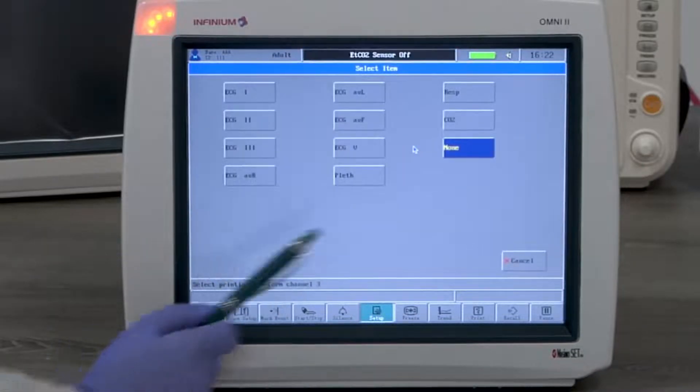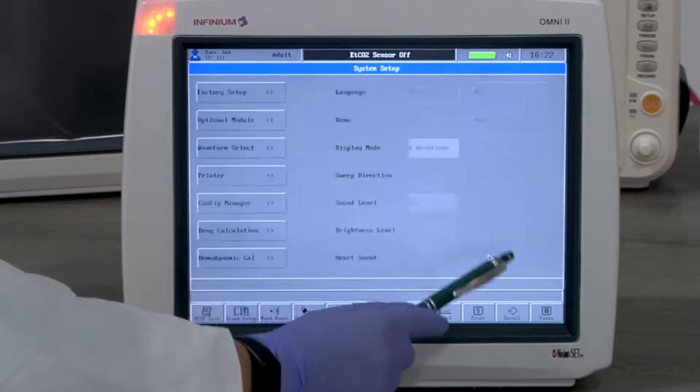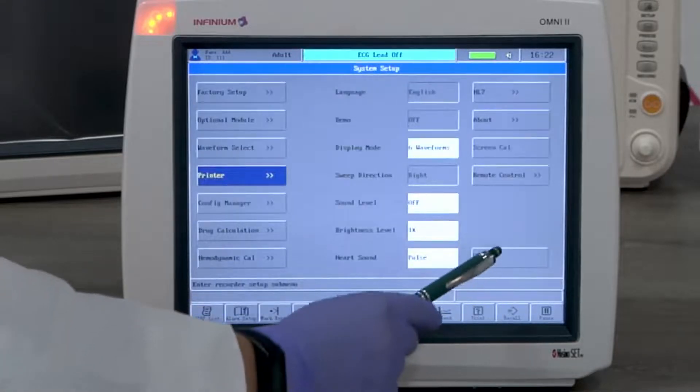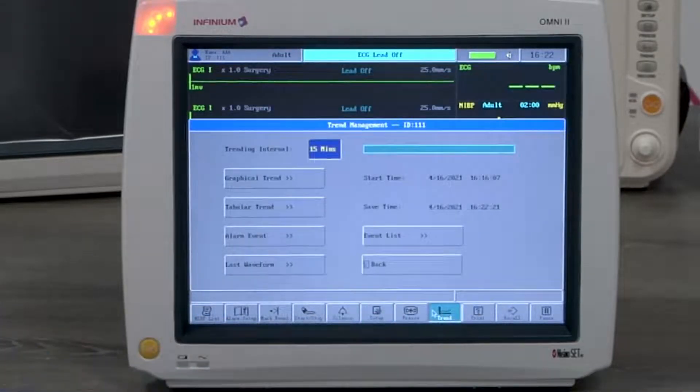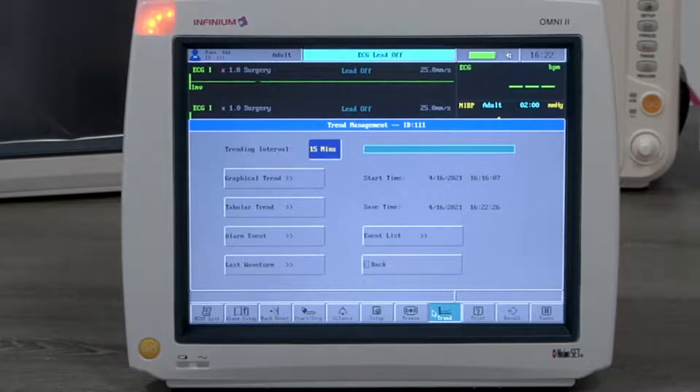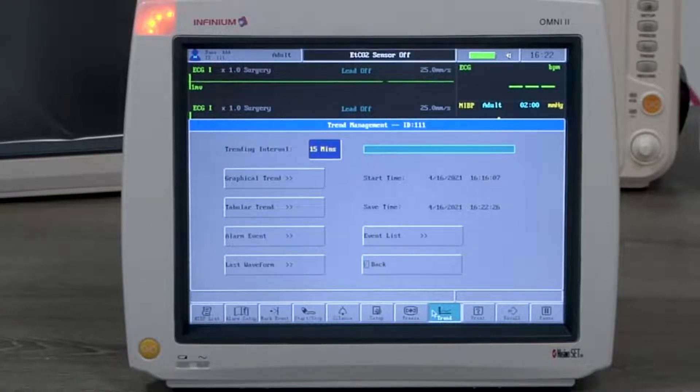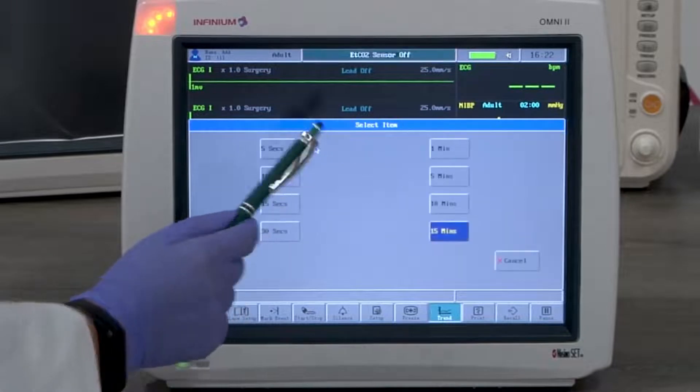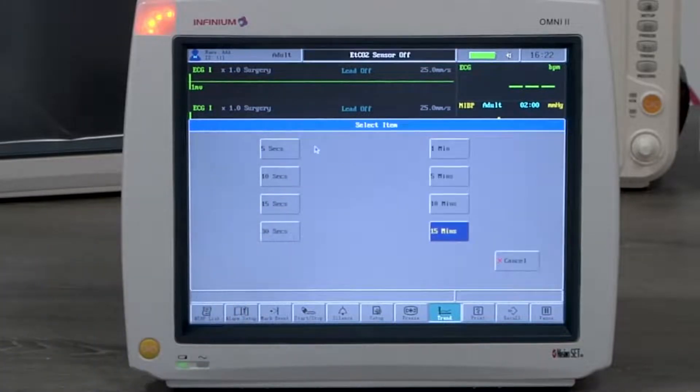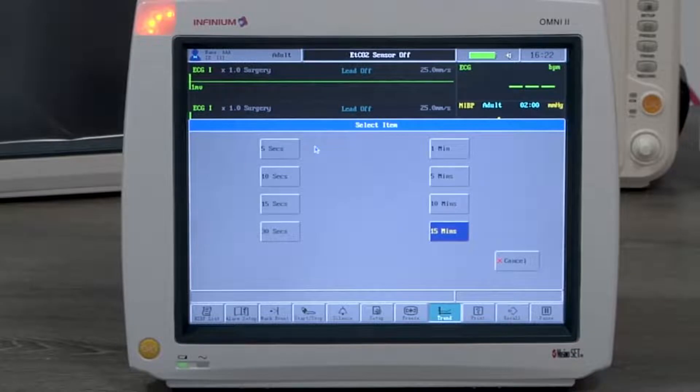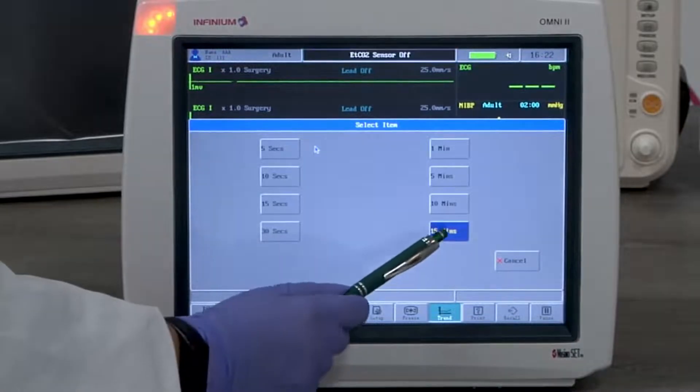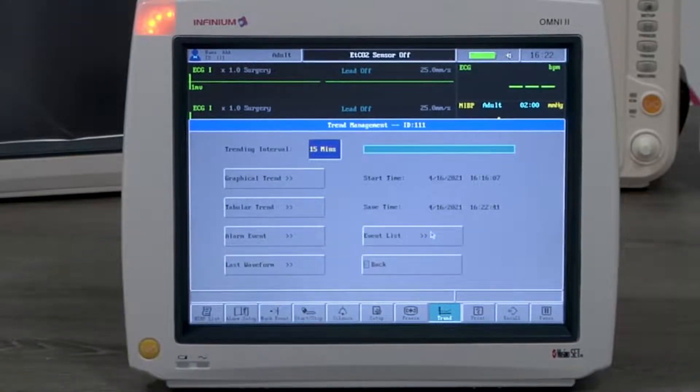Now let's take a look at data reviewing. The trend button will bring up trend management. Interval can be set per the user's preference. The maximum recording time is 120 continuous hours. The interval will need to be set to 15 minutes in order to display 120 hours.